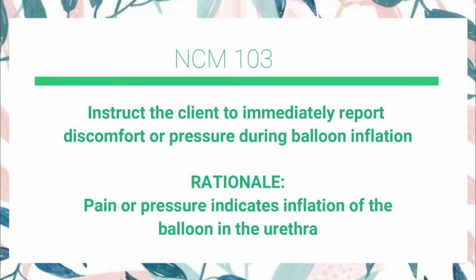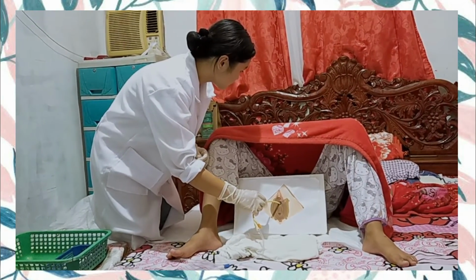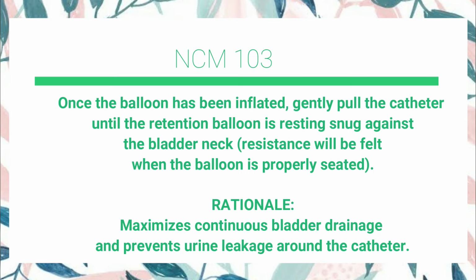Instruct the client to immediately report discomfort or pressure during balloon inflation. Pain or pressure indicates inflation of the balloon in the urethra. Do you feel any pain? Once the balloon has been inflated, gently pull the catheter until the retention balloon is resting snug against the bladder neck.